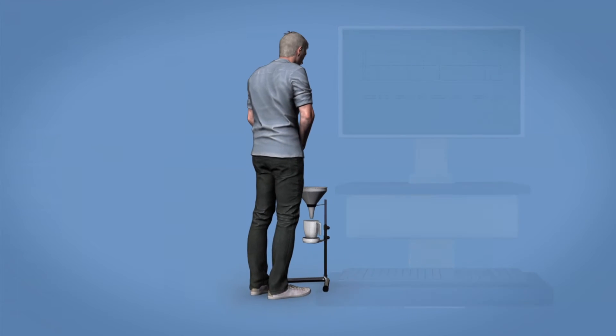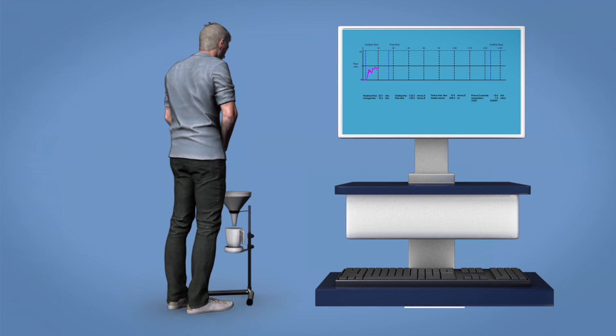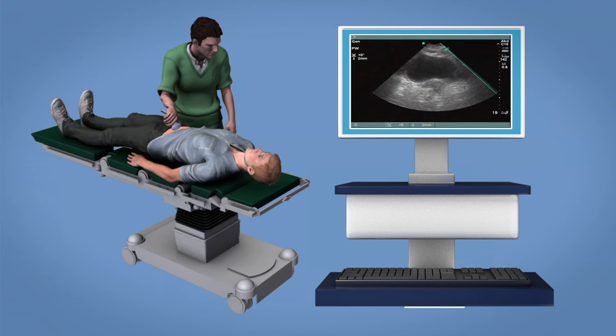Your doctor might begin with uroflowmetry. You will be asked to urinate on a special toilet in private. This toilet will measure the flow of your urine. Afterwards, an ultrasound of your bladder is made to see how well it emptied.